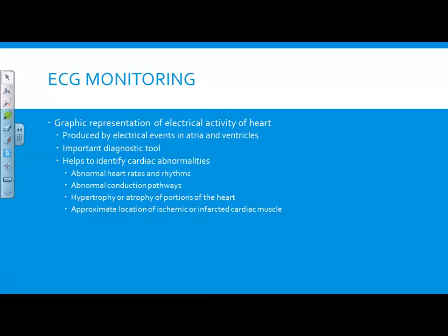You look at the monitor and you form field impressions, field diagnoses in your head based off of vital signs, based off of monitoring, and then based off of your physical assessment. Because there will be rhythms that we see here that we're going to expect signs and symptoms that relate to that particular rhythm.